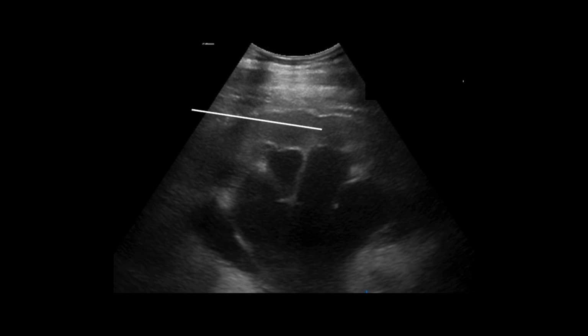The ratio? Well, no, I'm talking about the pelvis. So is there a measurement or is just... So for hydronephrosis, you're talking about mild, moderate or severe hydronephrosis? So mild hydronephrosis, the ureter is still normal, but the calyces, remember they start doing that. Okay, so that's mild. And then moderate, you get more dilatation with less than 1 centimeter dilatation of your proximal ureter. And then if it's more than 1 centimeter, your proximal ureter, then it's severe hydronephrosis. But obviously at that point, you're also going to have the calyx much more prominent.